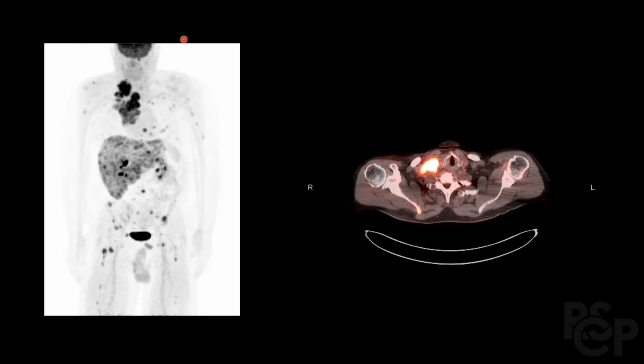So here are a couple more images of a PET scan. So the image on the left is a MIP scan, which is a whole body scan. The patient received FDG, and this is a 360-degree scan, so you can turn it around and locate all the areas of increased uptake. It's also important to distinguish the areas of physiologically increased uptake. For example, the brain will likely have increased uptake of FDG because it utilizes a large amount of glucose. So this is not concerning. It's a normal physiologically expected response. Same with the bladder. So again, it's really important to distinguish this from a pathological response.